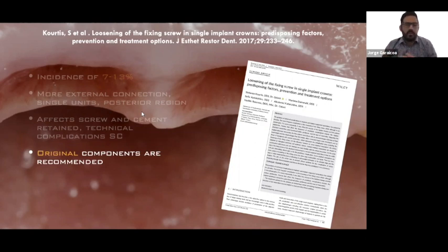That can be influenced by the roughness, by the hardness of the components, by the amount of load that you put on the tooth. There are many things that can affect that. But the companies are always investing money in research, doing tests, so they can improve that, so you have less loss of torque down the road.